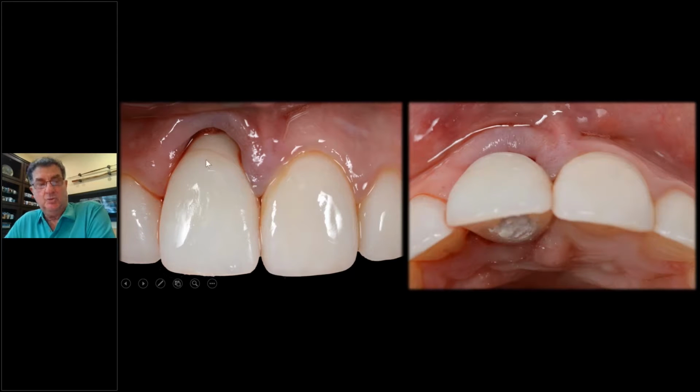That will allow no over contour here. Here we want the tissue to come down. As you know, Weisgold told us that on teeth. Under contour lets tissue come down. Over contour, tissue moves up. So we're going to let it come down.